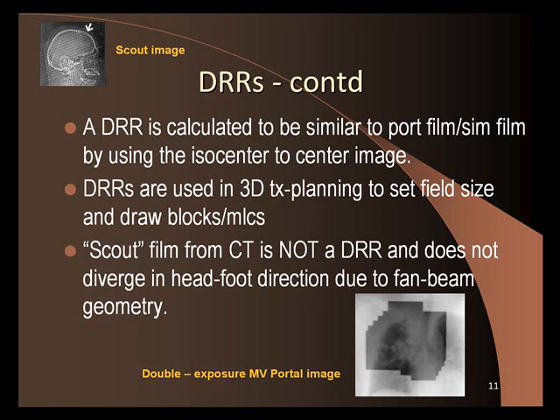Okay, and then a port film. Port film is the actual delivered treatment field. It contains isocenter and blocking information.